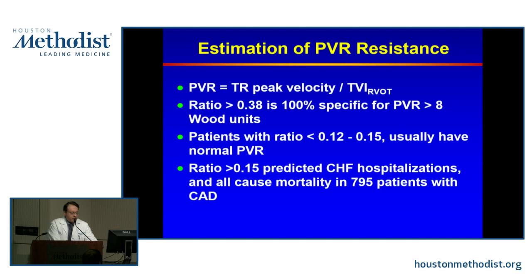Pulmonary vascular resistance, the actual expression in the cath lab, calls for getting the mean PA pressure minus the mean wedge pressure, and you divide that by the cardiac index. Dr. Schiller and his group advocated summarizing this approach and said, let's use the TR peak velocity as a surrogate for that numerator. You can see that the peak TR velocity is very far from the other items that were needed. It's not the mean pressure, and it doesn't account for the wedge pressure.